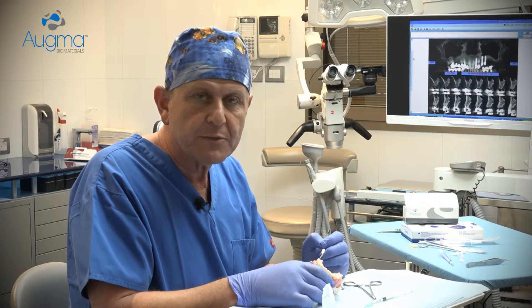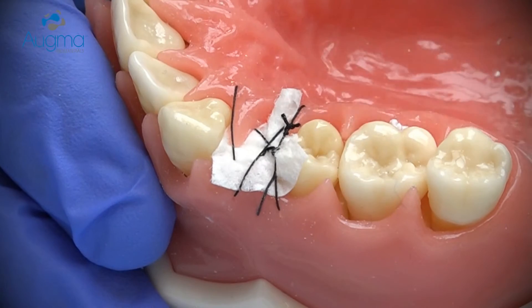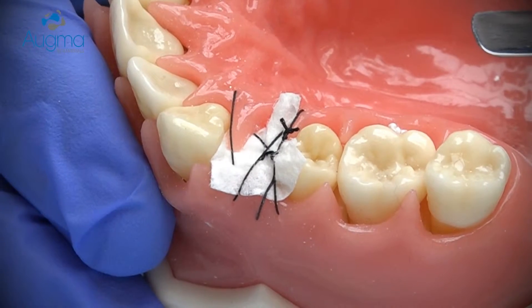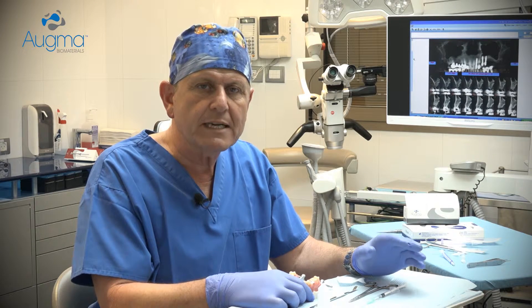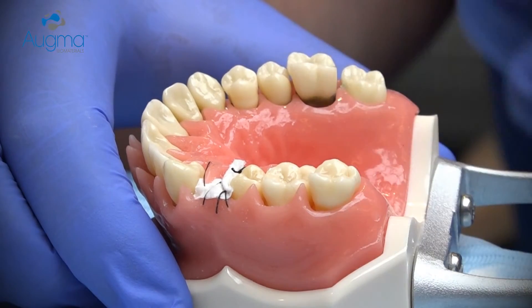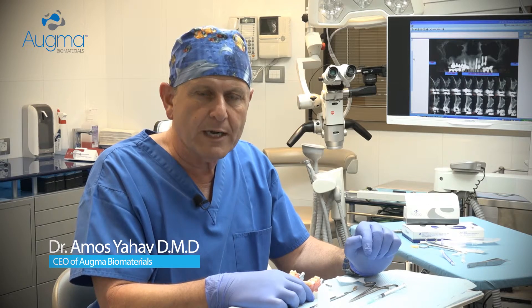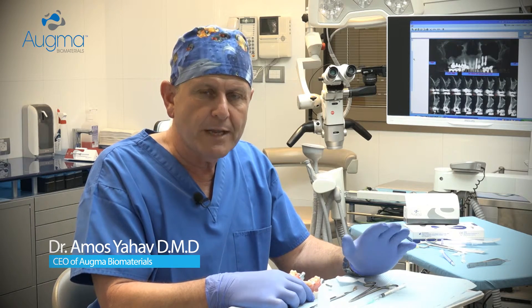That's how it should look when you finish the procedure. Soft tissue will migrate above the graft and in two weeks the grafted site will be covered by soft tissue. Due to the transformation of the graft into the patient's own bone, the radiographic appearance is completely different than what we are used to see with other grafts. On day one it will appear radiopaque. After one week, radiolucency will appear at the border. By three weeks, a complete disappearance of the graft will be reflected by radiolucency on the radiograph — this is the time that the osteoid is formed before calcification. By three months, radiopacity will be gained again with the same trabecular form of the bone.